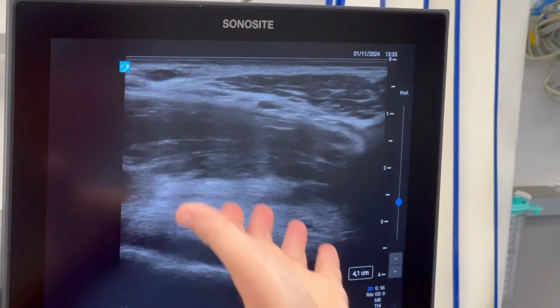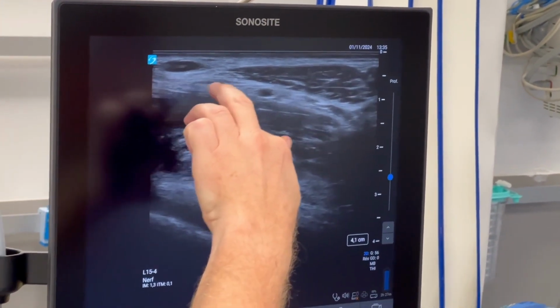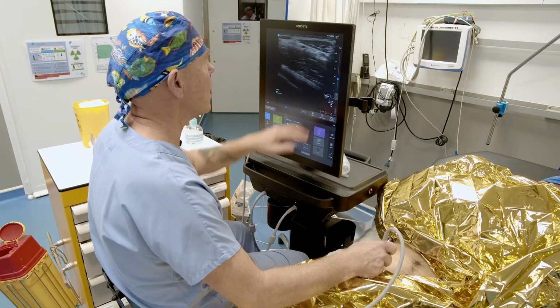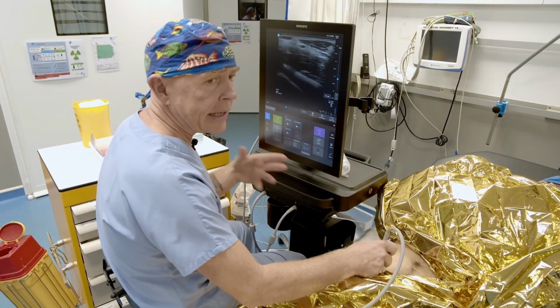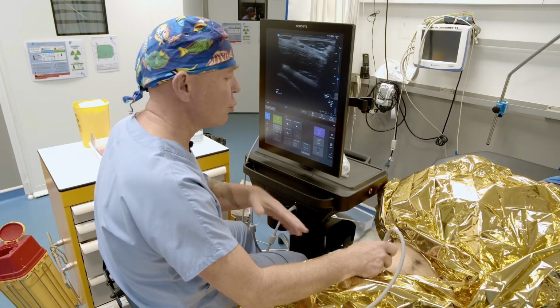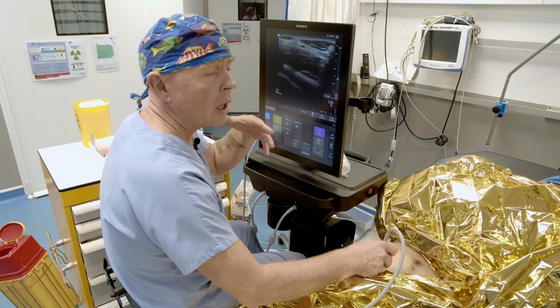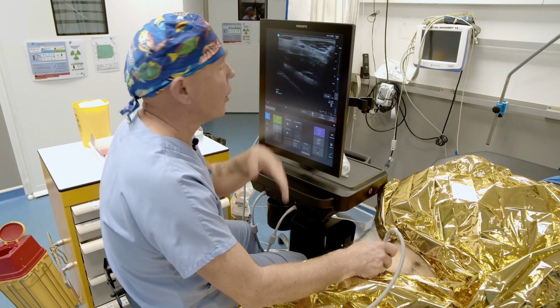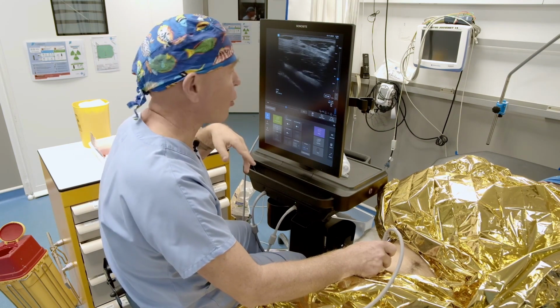So you come in from here, and I recommend injecting a little bit below the fascia in order to make the circumflex artery rise, and you'll have the product spreading up to the femoral nerves. So let me remind you that the suprainguinal approach to the iliofascial block is an exceptional block for all lower limb surgeries, especially knee surgery and femoral neck surgery, and all of that. And it covers the 3 blocks, the 3 nerves, so it's the famous 3-in-1 Winnie, but adapted for ultrasound guidance. And your main landmark is the artery, the circumflex artery.